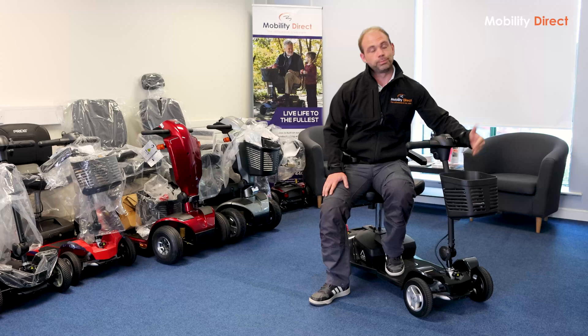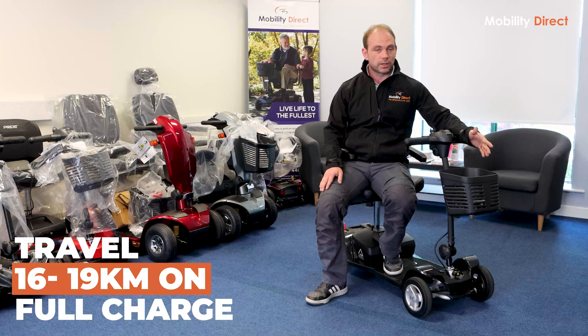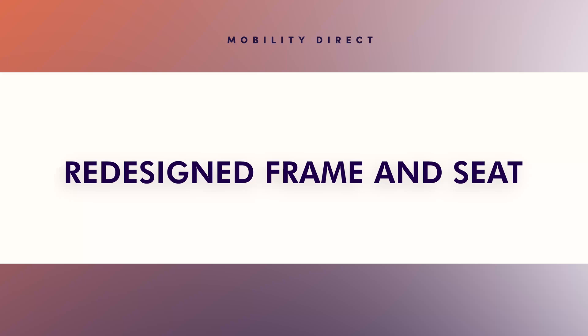Not only is it a lot lighter, but you can actually travel a lot further on it. One of the limitations with the older Apex Light model is that you can only do maybe 5 to 8 kilometers on a full charge, which for a lot of people wouldn't be enough. On this one, you can do up to 16 to 19 kilometers on a full charge. So not only is it a lot lighter, but you can actually travel up to 2.5 times the distance — it's a win-win situation.